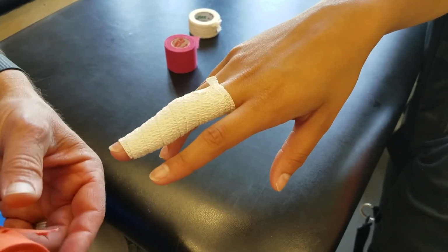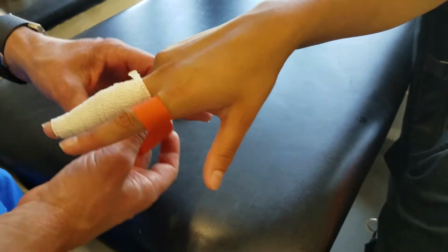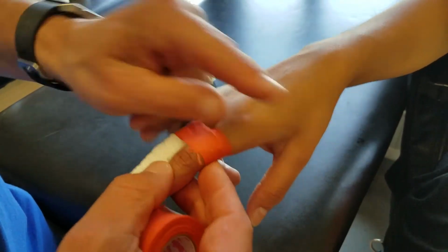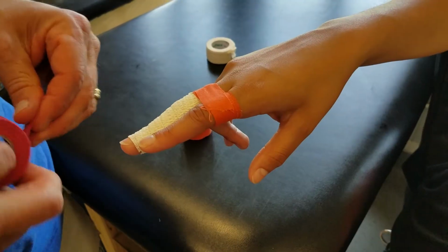What I'll do is always anchor my tape down to the non-injured finger first, and then come through and pull that together. So that's once around, twice, that's it. And try to end your tape on the dorsum, the top of the hand or the fingers. And then here, I'll do another one right here.